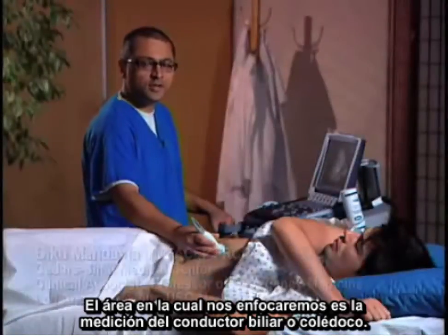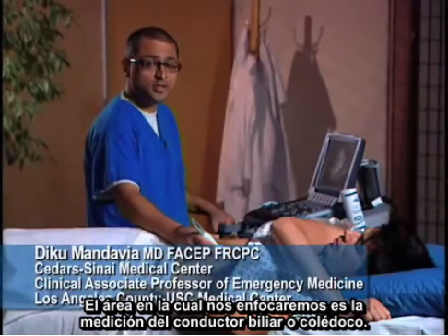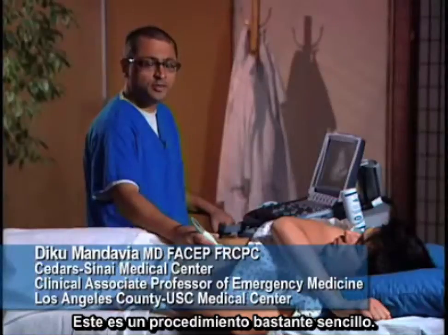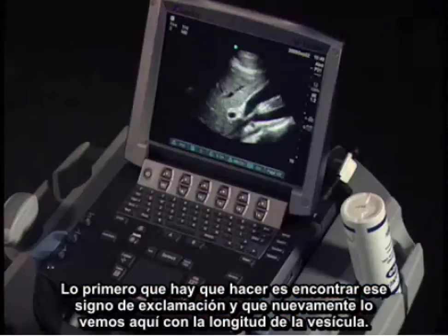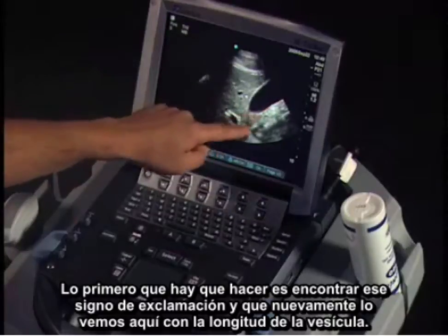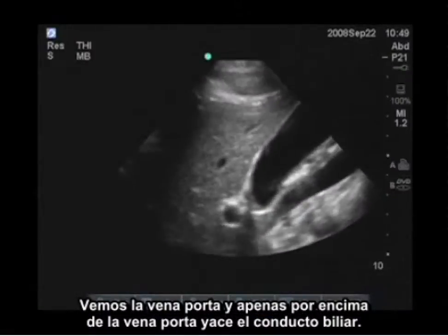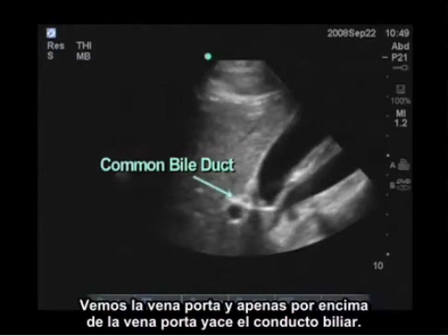A more advanced area you may want to look at is actually measuring the bile duct. That's a pretty straightforward procedure. First, find the exclamation sign — we see it here with the gallbladder and length. We see the portal vein, and just above the portal vein lies the bile duct.